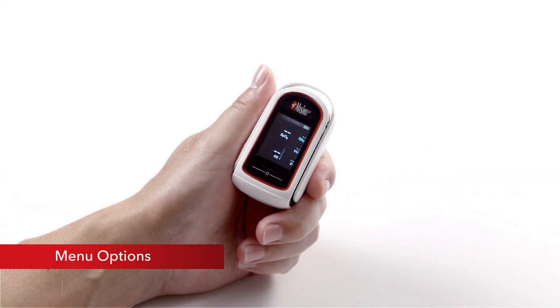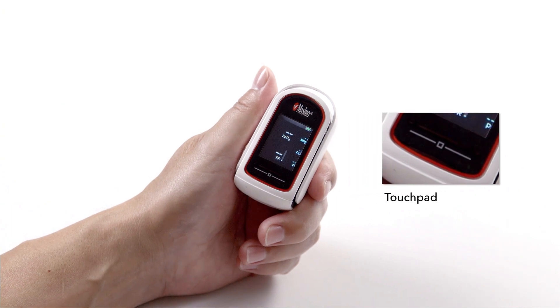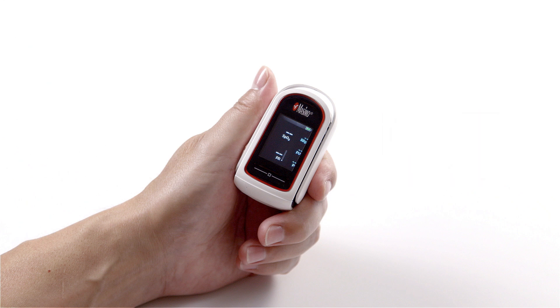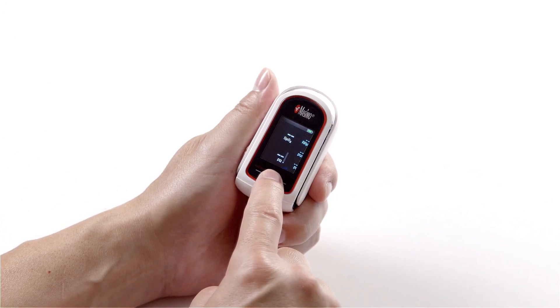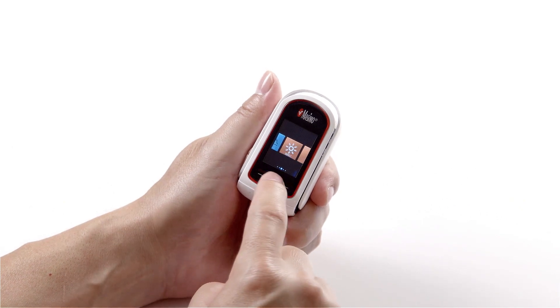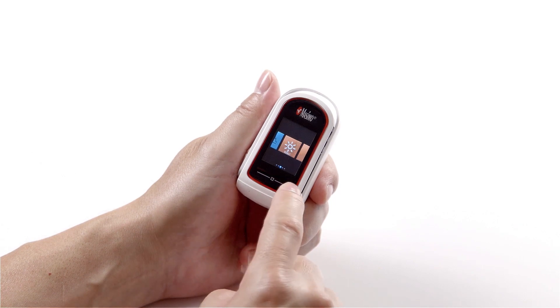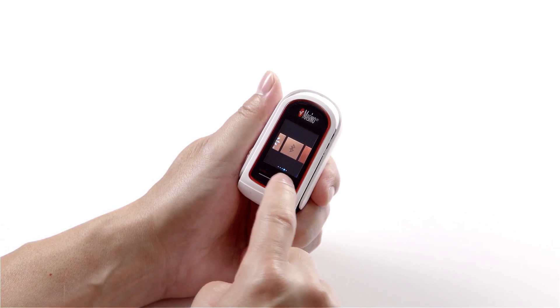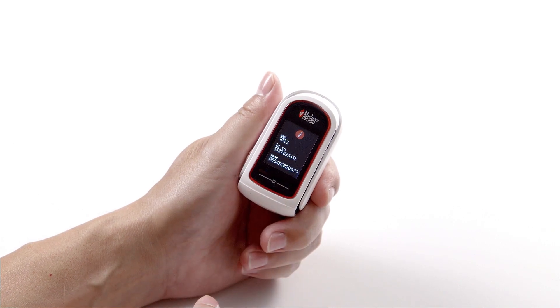The MidiSat RX features a touchpad located below the display screen, allowing users to access the main menu and configure device settings. To access the main menu, press and hold the touchpad until the menu appears. From this menu, the user can enable or disable the waveform on the screen, increase or decrease the brightness, activate or deactivate Bluetooth, or find hardware and software information about the device.